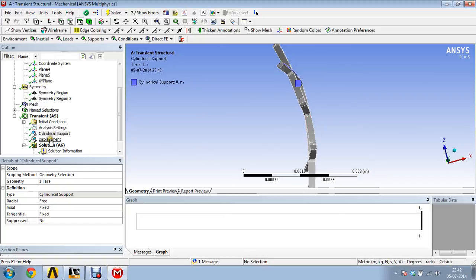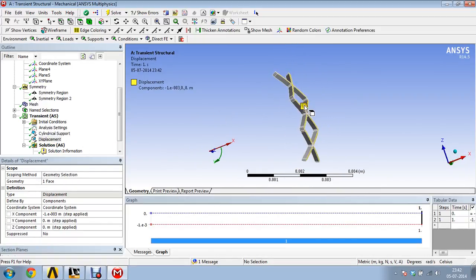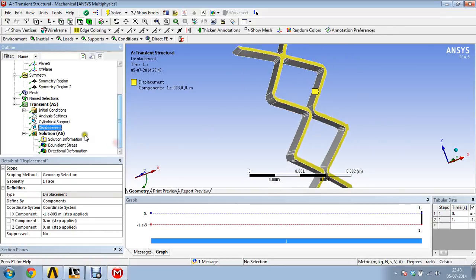We'll see further. What we have given is a displacement to this upper boundary, around 1 mm, in the negative direction. So it should compress. There would be some tensile stresses on this boundary and compressive stresses here. So let us see.